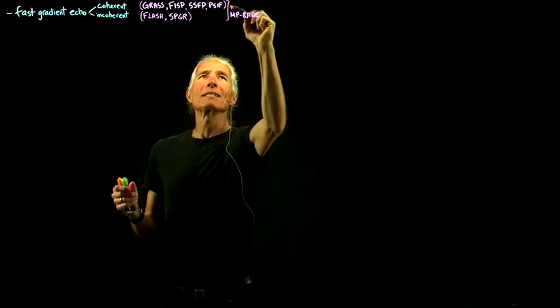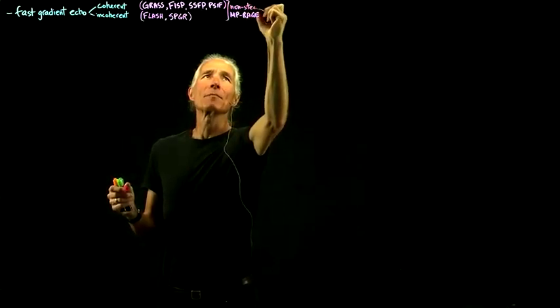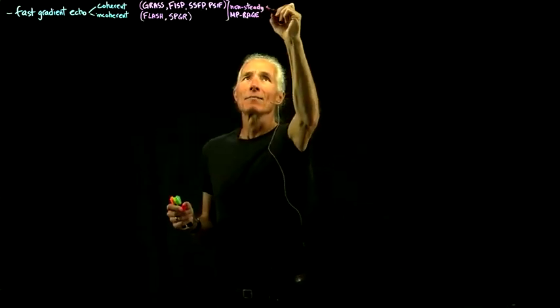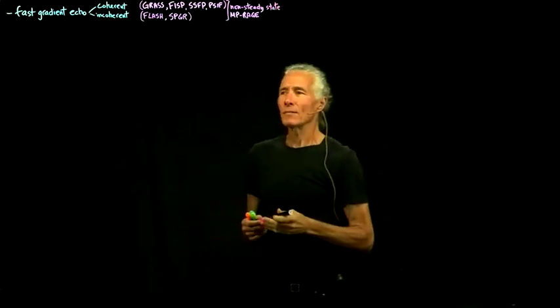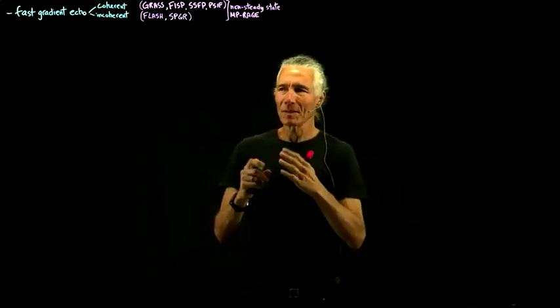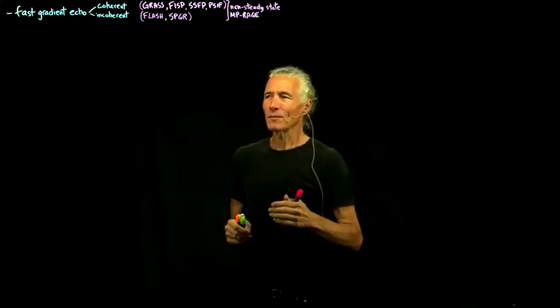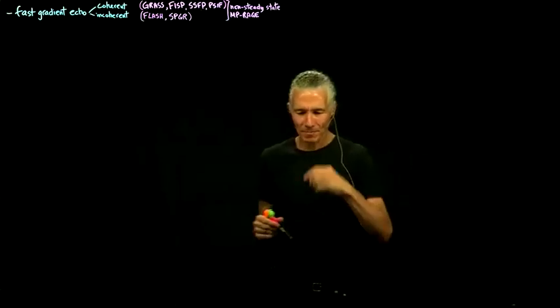This one's a non-steady state, but this one's extremely common. This is probably one of the most common structural scans that we use at the MRI center, and it's used all around for basic gray-white contrast, just to make something that looks like what you think of as a brain, with the white matter lighter than the gray matter.